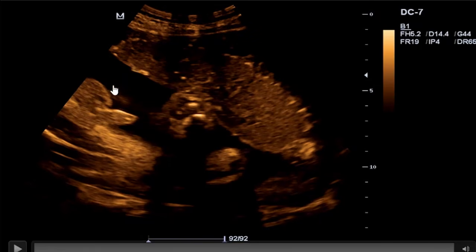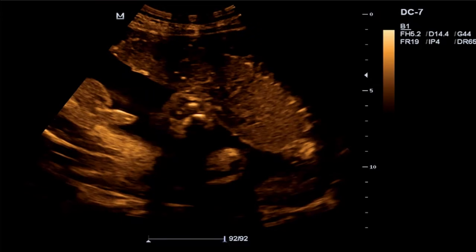If this placenta comes and overlaps this testicular part, you cannot differentiate the two. So this amniotic fluid, when it is adequate, works as a window for us to determine the fetal genitalia with ease. So in brief, this is it in terms of fetal sex determination.